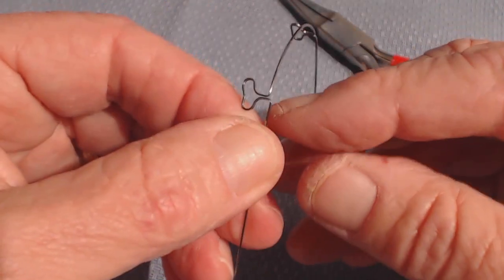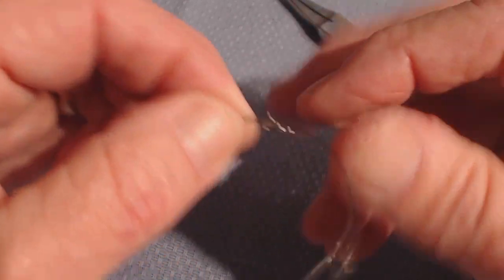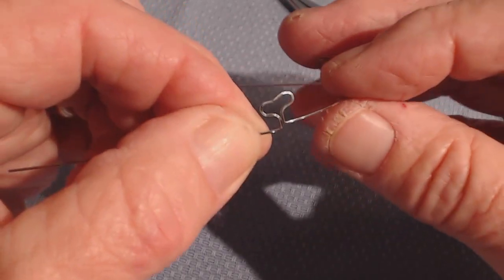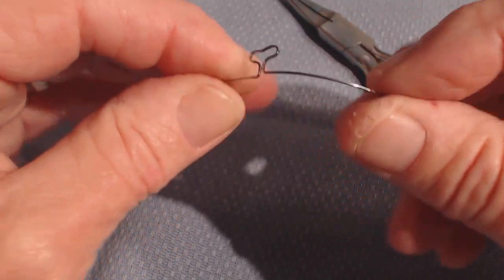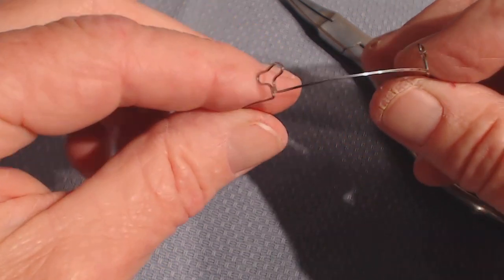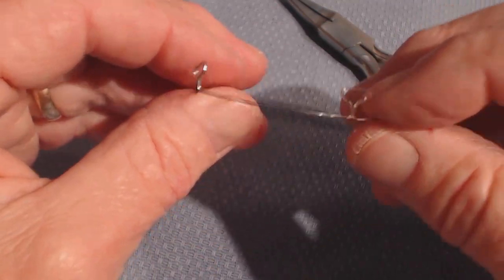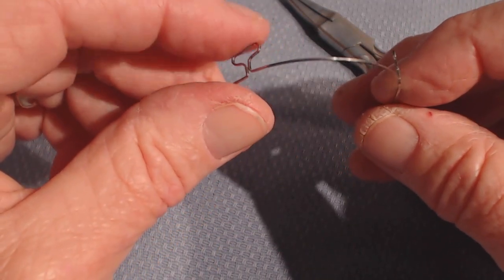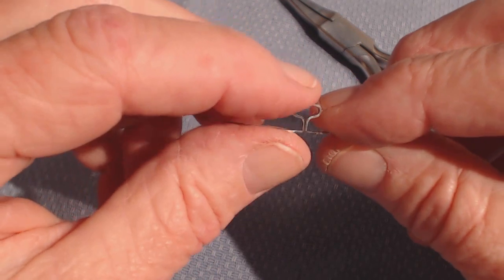this is a half millimeter. I just eyeball two wire widths and that's all you need. But if you want to measure it with a ruler, go ahead. The loop has to touch together again. The loop should be parallel in this plane of space so there's no additional torque. This was a very nicely executed intrusion bend—you would duplicate it on the other side.